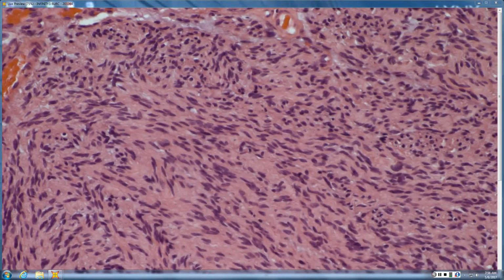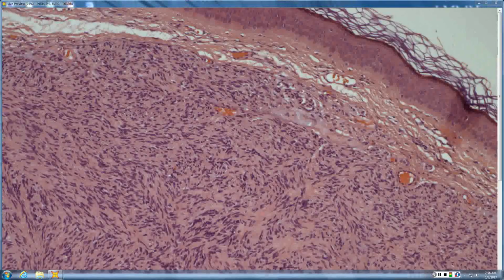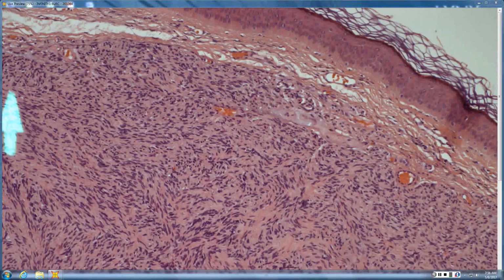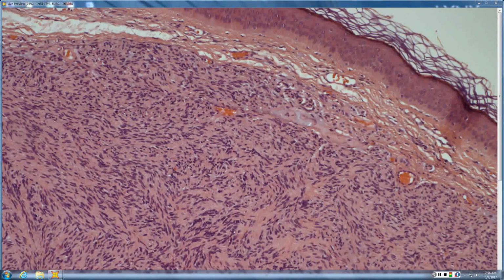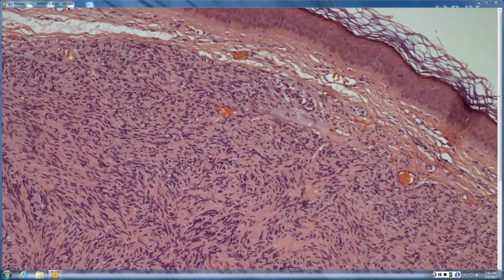Black. So, no question, schwannomas tend to be deep and encapsulated, but the other thing is this one doesn't break up into good fascicles, and it's not vertically oriented, which is why you're not thinking PEN. Yeah, but that's what they called it, palisade encapsulated neuroma.